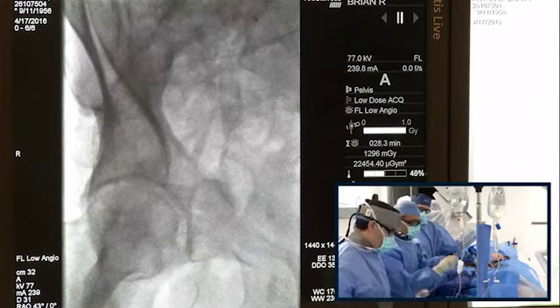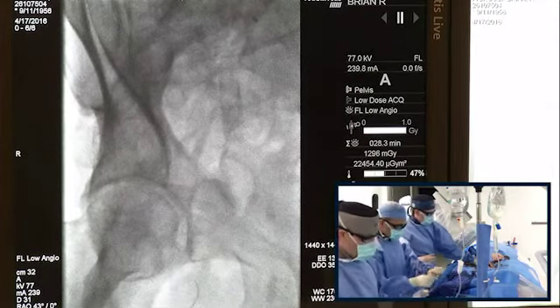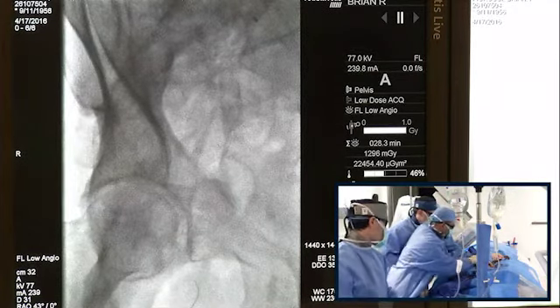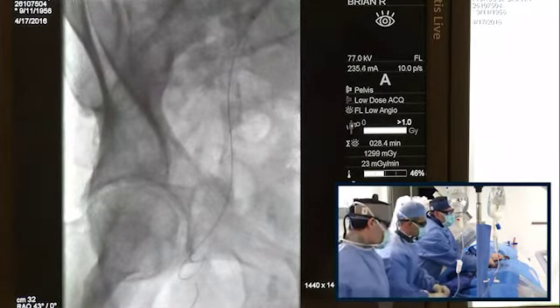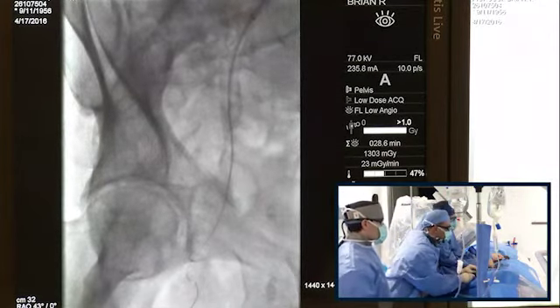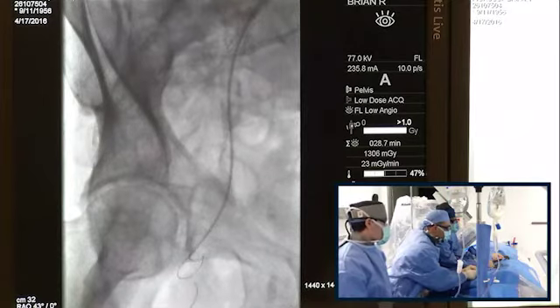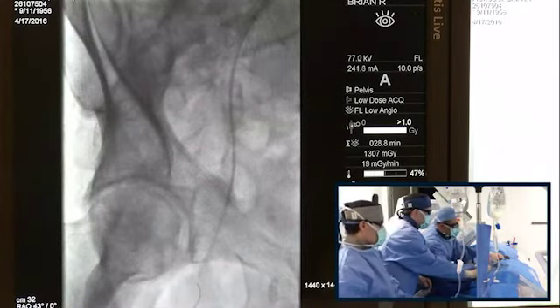So I'm going in now with a multi-purpose catheter. This is 6 French. I think we may be able to hopefully get this to the knob. Okay. Can I get a 5 by 60 balloon, please? Okay, go ahead. 035. Put it working. Wire came back in. That's okay. Go ahead. Easy, easy, easy. Yeah, go ahead. It's hard to see this. Okay, one second. Go ahead. Okay, stop. Let me get in there. So let's see if this multi-purpose works. Can you bring a 5 by 90 sheath, please?